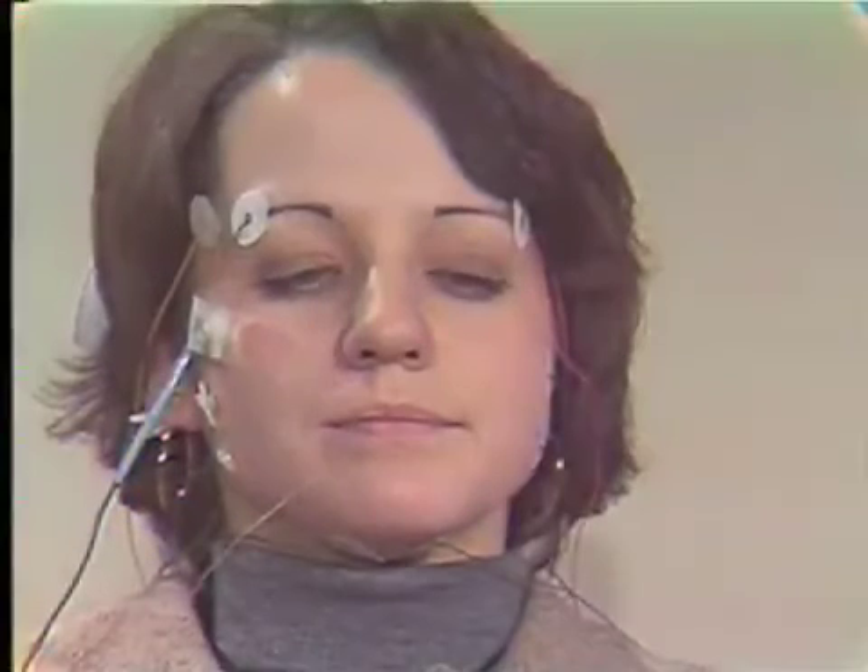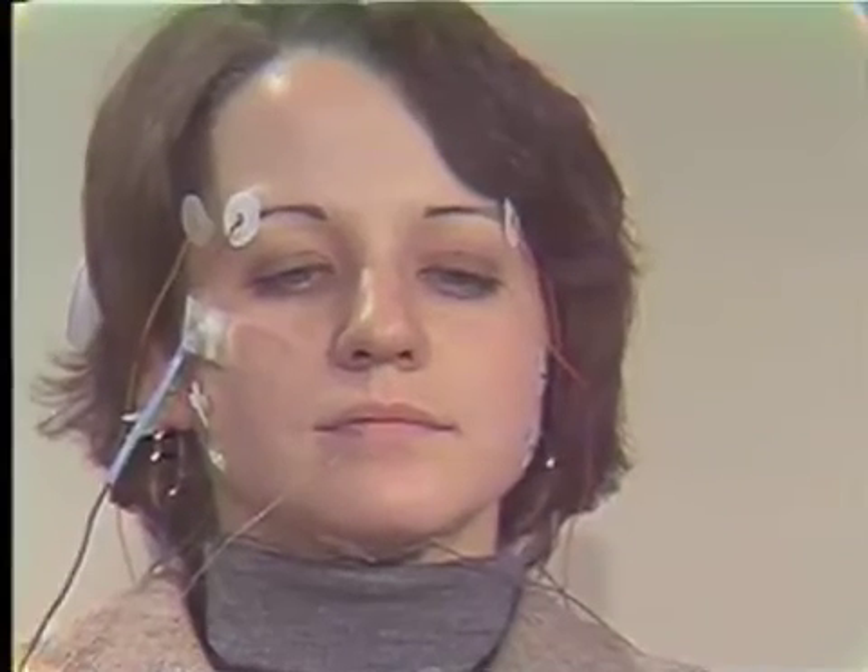Now we would like to watch Karen and the scope while performing exactly the same procedures. Karen is superimposed so we can see what she's doing. Okay, now give us a clench — a nice hard clench. Notice the activity, relax. And that gives us a relationship of how much activity she's using relative to what she can use.